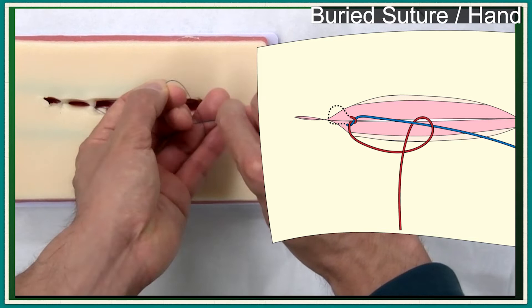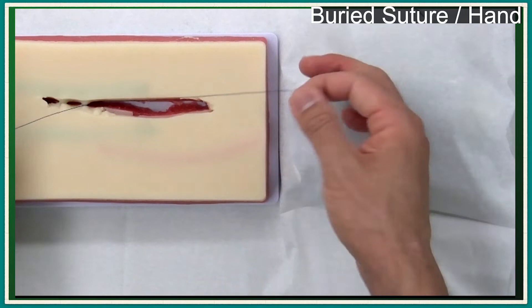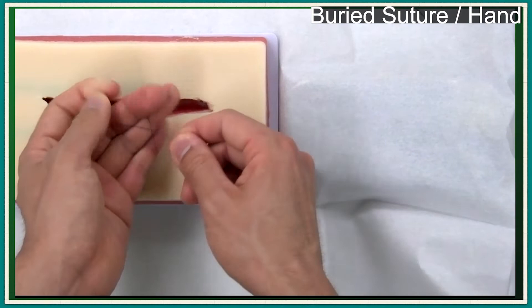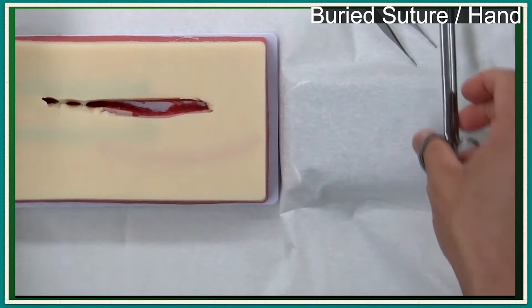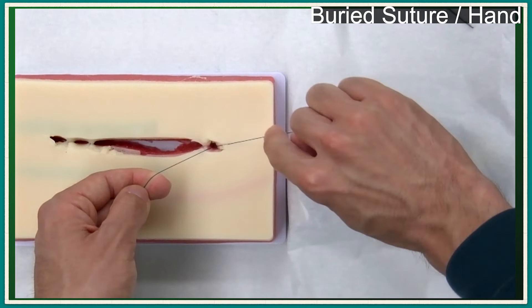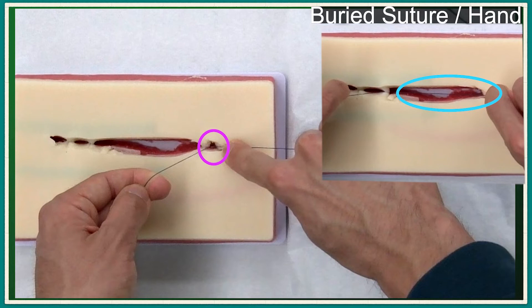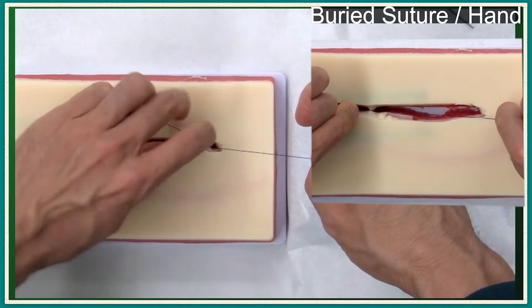With pulling the right hand end continuously, the knot is secured by one-handed knot tying by your free left hand. Send the knot underneath along the right hand suture. After the knot is secured, additional knot tying is performed. If you start the wound closure from the right side, you should test the tension in the narrow space, and it's also difficult to send the knot underneath from the narrow side. In buried suture, you should decide from which side to start considering your knot tying procedure.